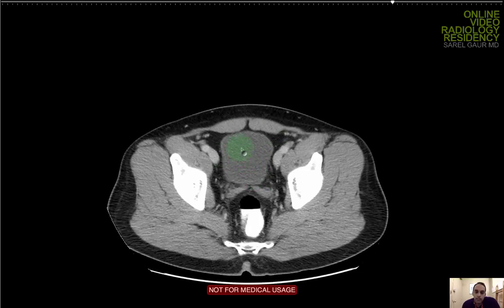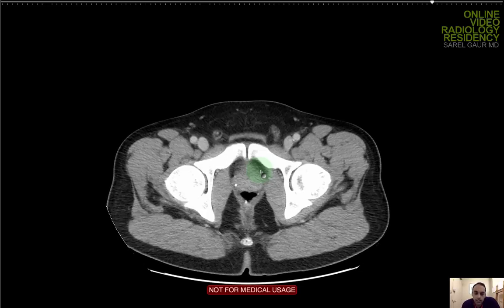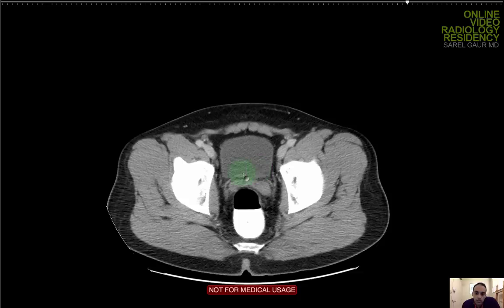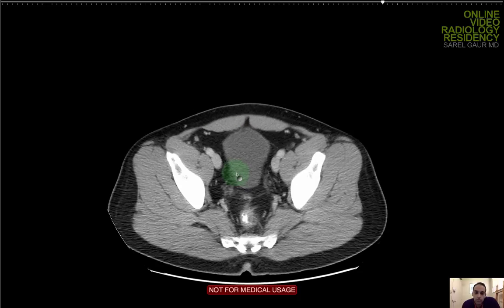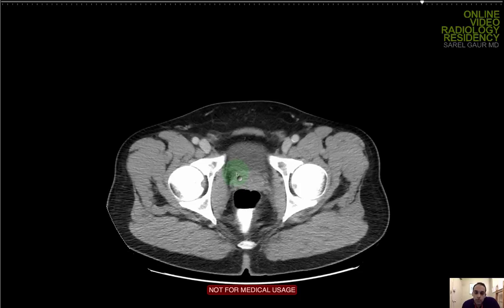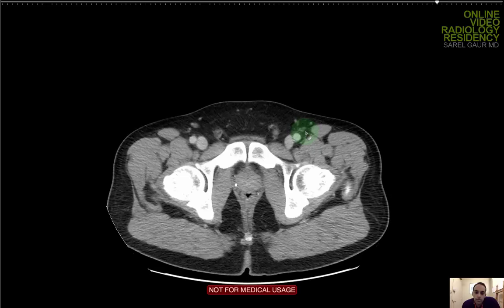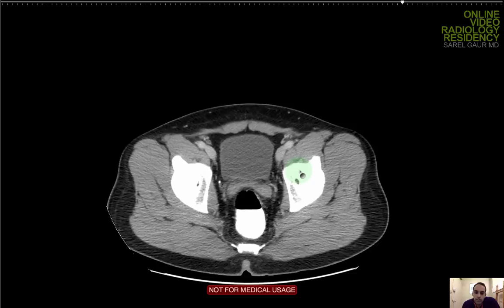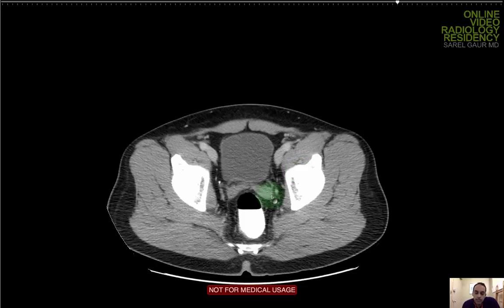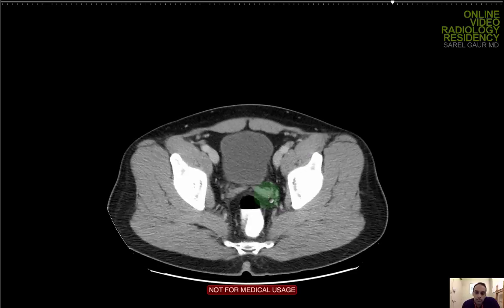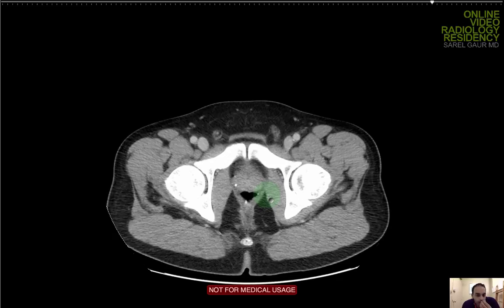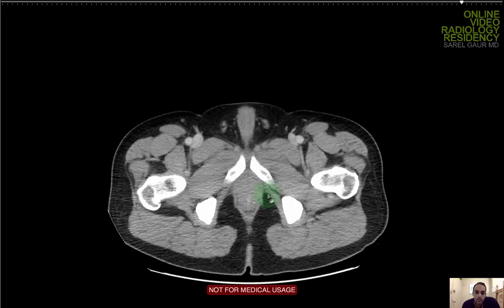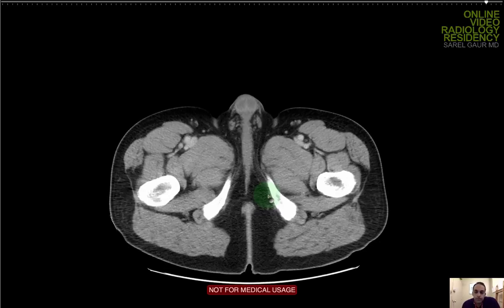Now I'm at the level of the bladder. Quickly looking at the bladder — it should just be full of urine, no lesions on the bladder wall, no wall thickening. The bladder is unremarkable. Continuing down, I can see the prostate, which is normal in size. Coming up a little bit, I can see the seminal vesicles — symmetric in size bilaterally, no focal lesions. The seminal vesicles are unremarkable.